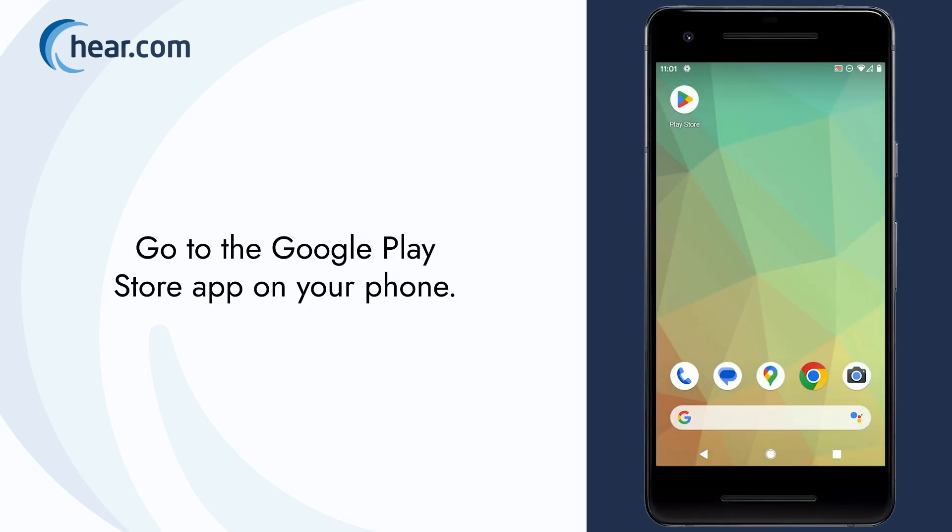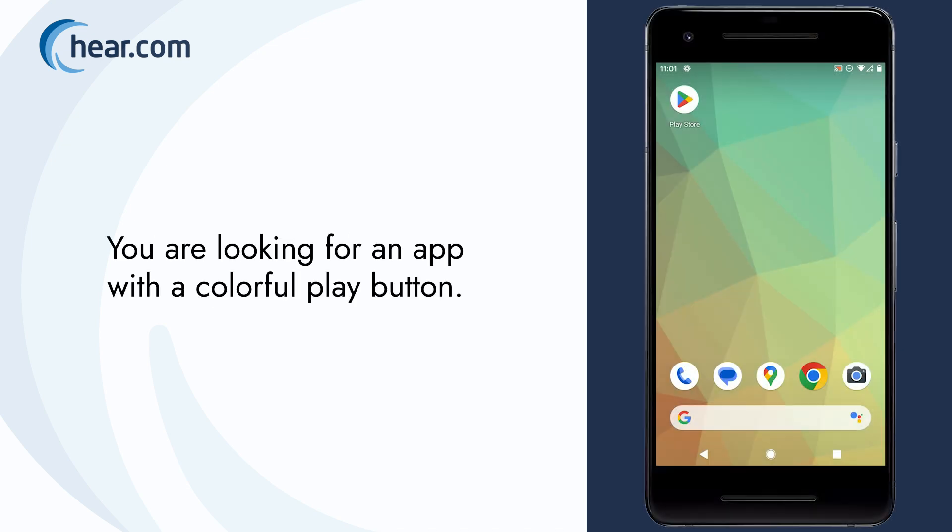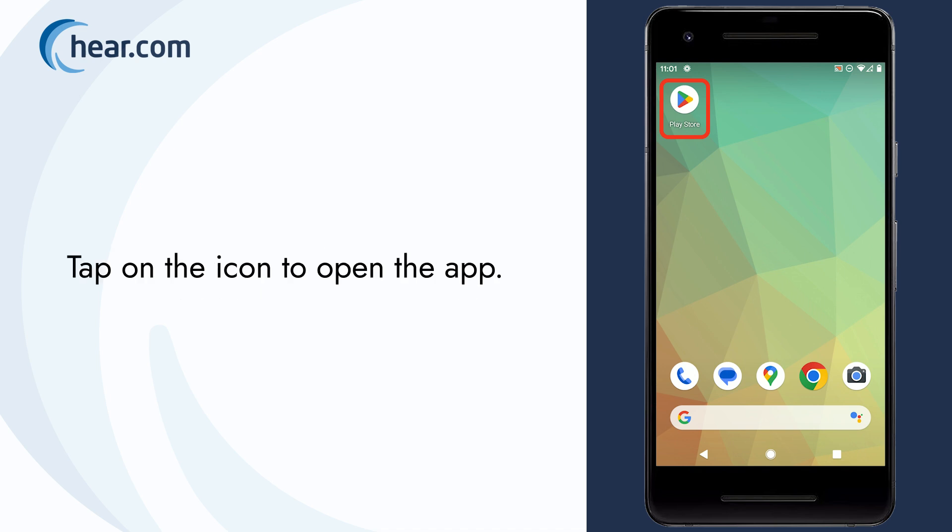Go to the Google Play Store app on your phone. You are looking for an app with a colorful play button. Tap on the icon to open the app.